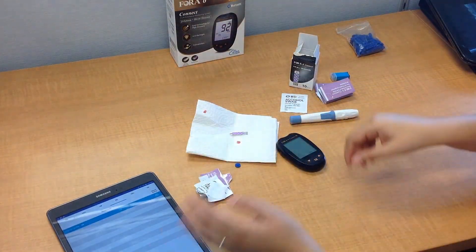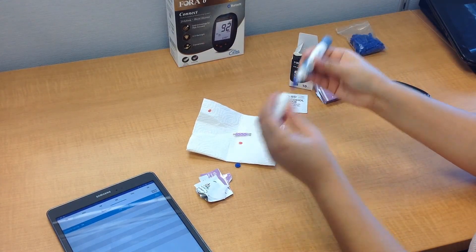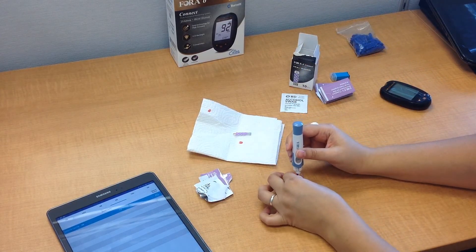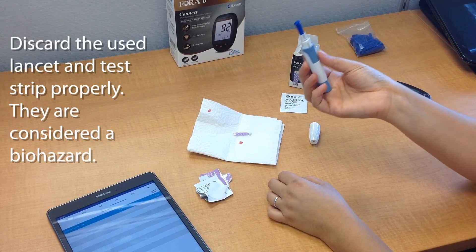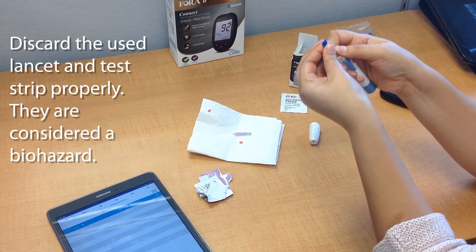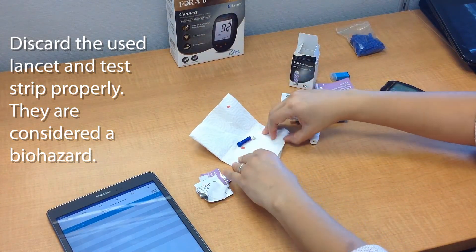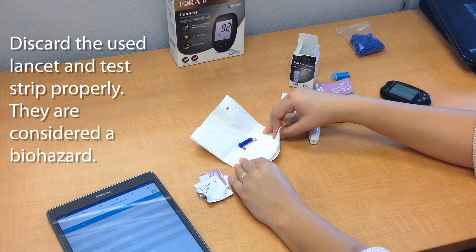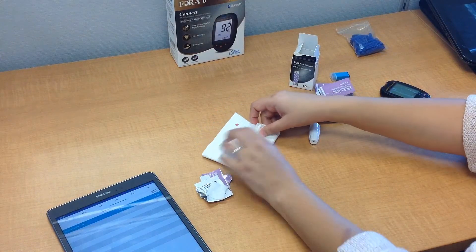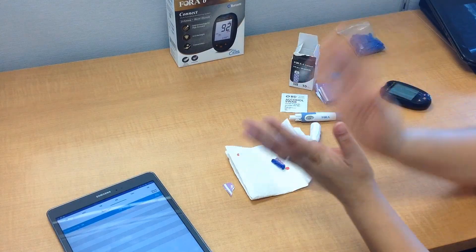Before you finish, open up the lancing device again. Take the safety disc that you removed at the beginning and press it down to cover the needle before you dispose of it. When disposing of the needle and the testing strip, make sure you keep them out of reach of children, other people, and pets, because they are considered biohazard material and any kind of disease can spread. Dispose of them appropriately. And that's it — you just finished your very first blood ketone test.